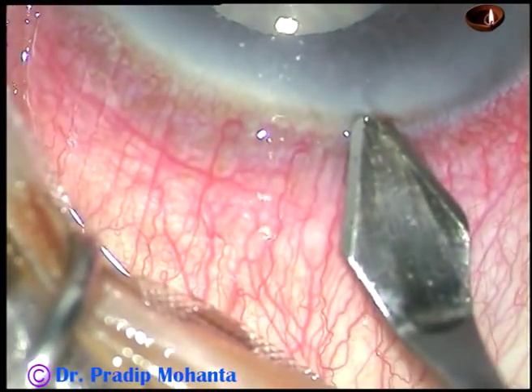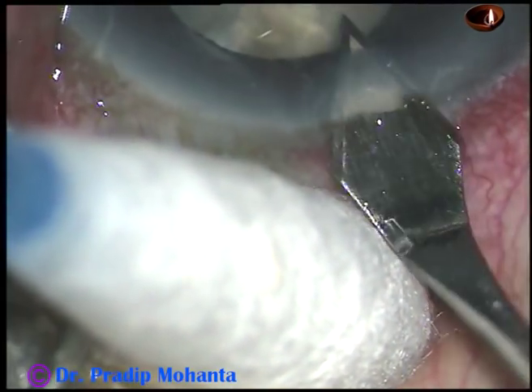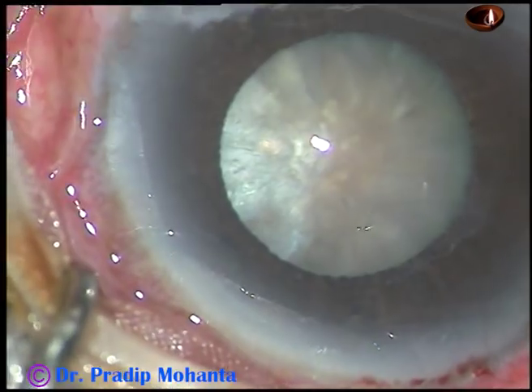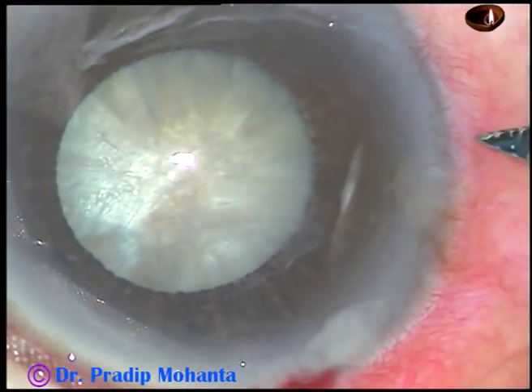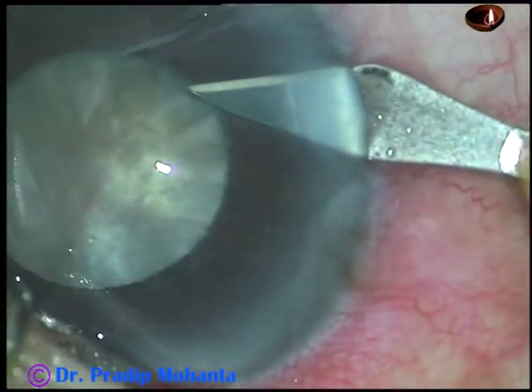Now, this is the incision — a 2.8 mm main incision on the posterior aspect of the limbus. And now, one paracentesis on the right side of the main incision, about 3 clock hours away.